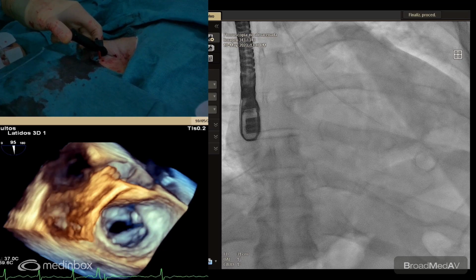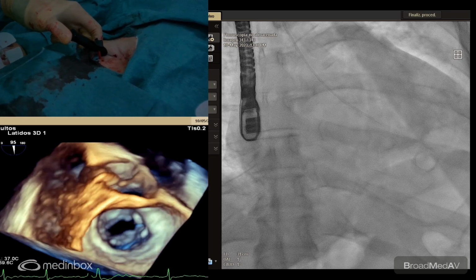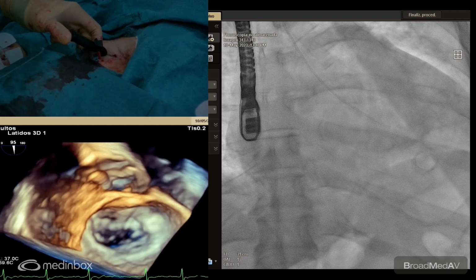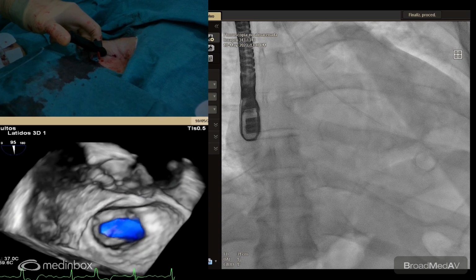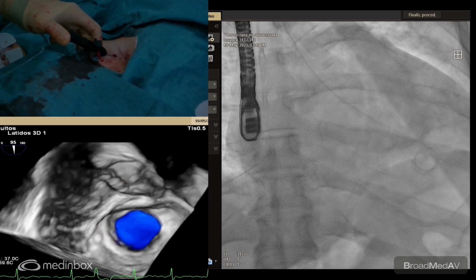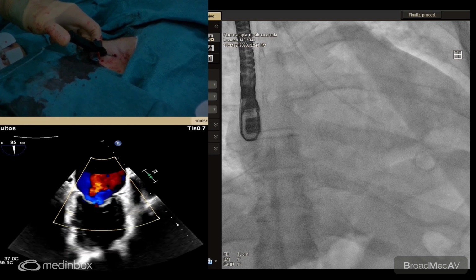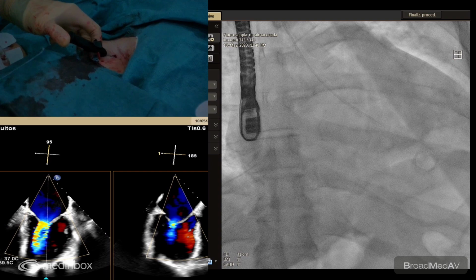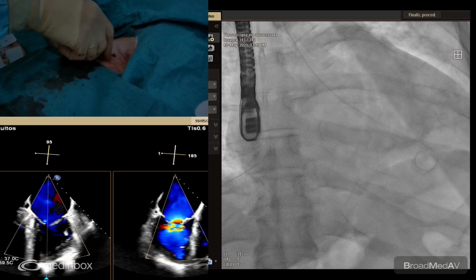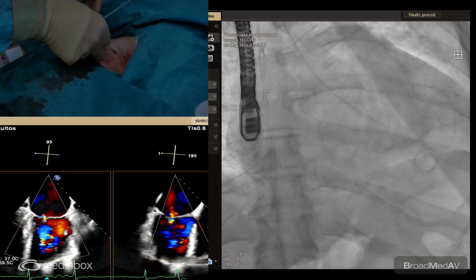So some people use this Proglide to close even the veins when there are big bore accesses, and some people do some compression or other tricks. We have very good experience with this approach with mitral clip and big sheaths. Okay.